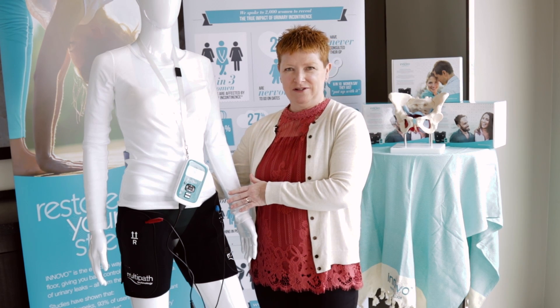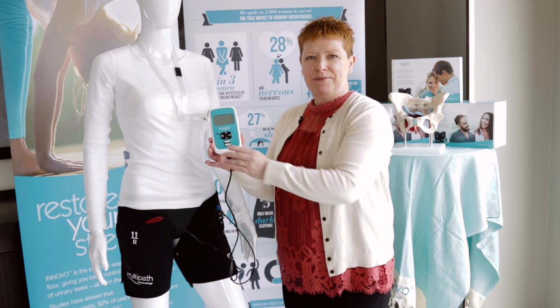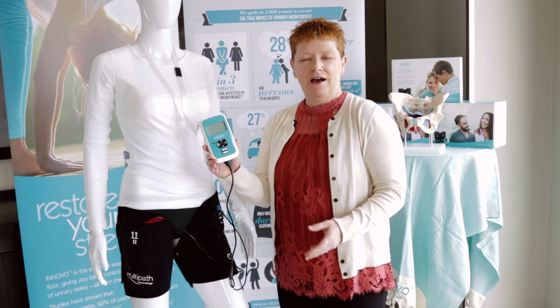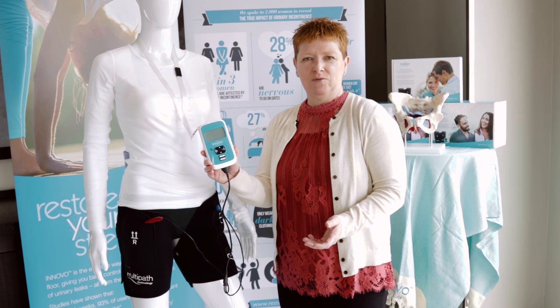The user just has to put the shorts on and select an appropriate program on the controller to treat the symptoms of stress incontinence, urge incontinence, or mixed incontinence, depending on which one they have.